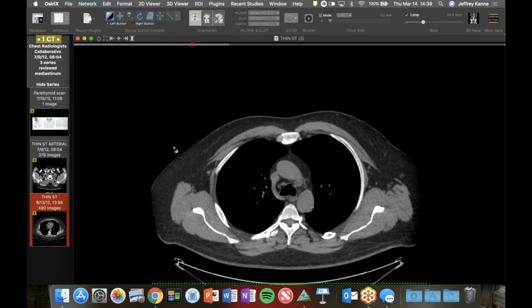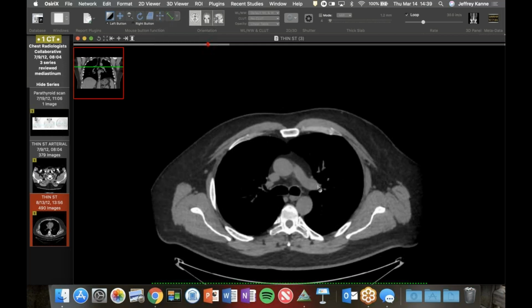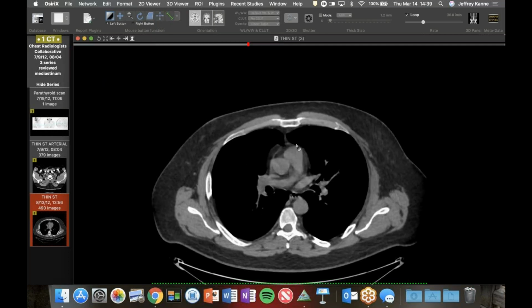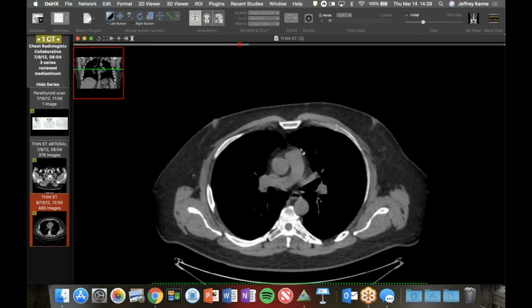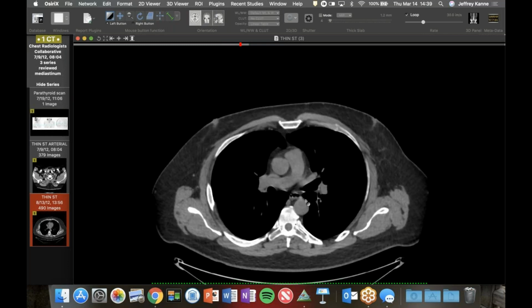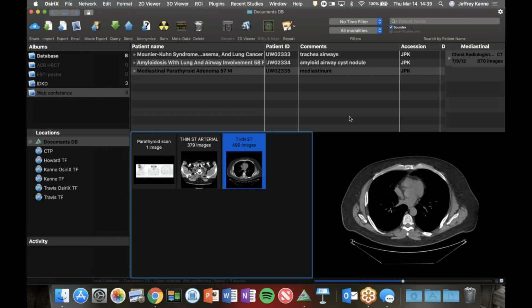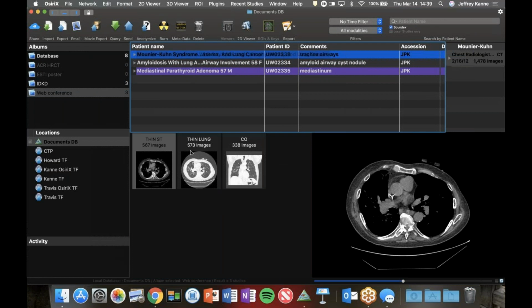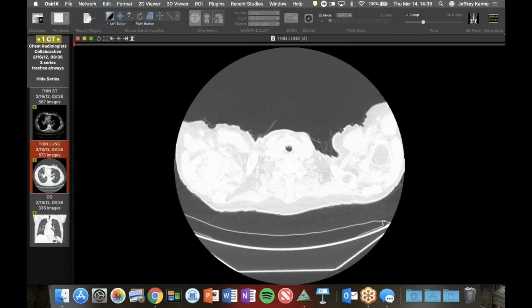I don't think we ever find these prospectively, but it's probably the second most common place I've seen them. I don't know what's published, but the ones I've seen frequently occur in the anterior prevascular mediastinum, right along the pericardium, right up against it. But they can occur anywhere along here. I think I've seen one written about or described more posteriorly, but that's even in a slightly atypical location. The vast majority in the mediastinum are just sitting right by the thyroid up in the thoracic inlet, the tracheoesophageal groove area and such, perhaps.